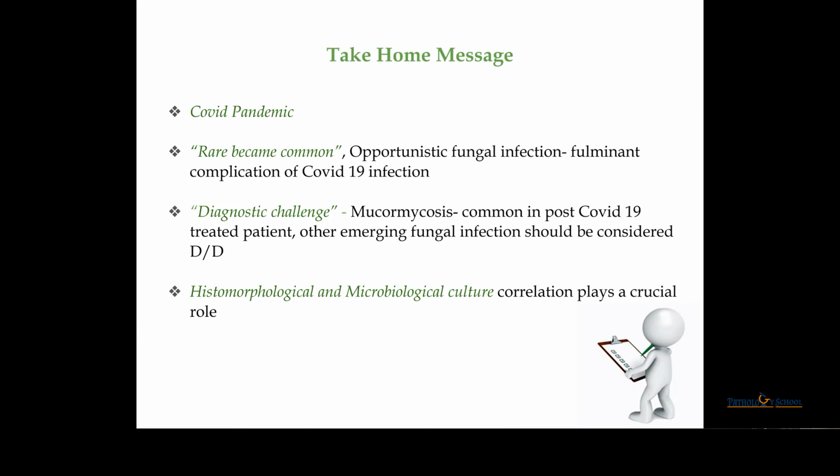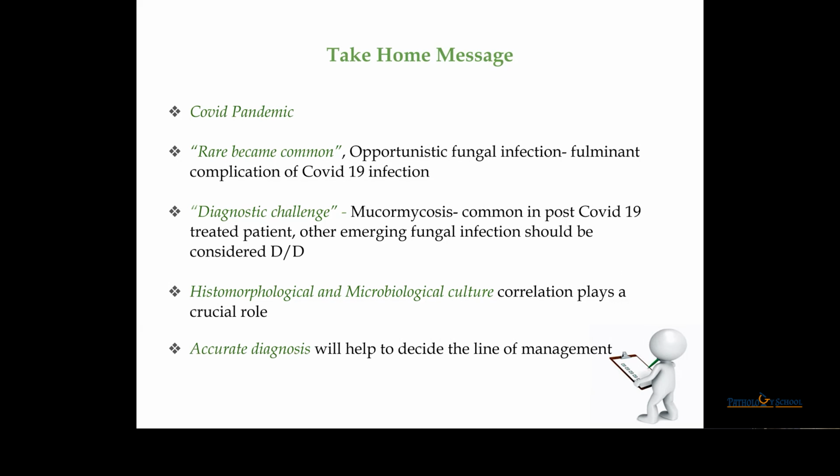So here comes the role of microbiological culture. While dealing with such a rare fungal infection, histomorphological and microbiological culture correlation should be done, as an accurate diagnosis is the main factor in deciding the line of management. It is very helpful for the patient, as these are very fatal infections.